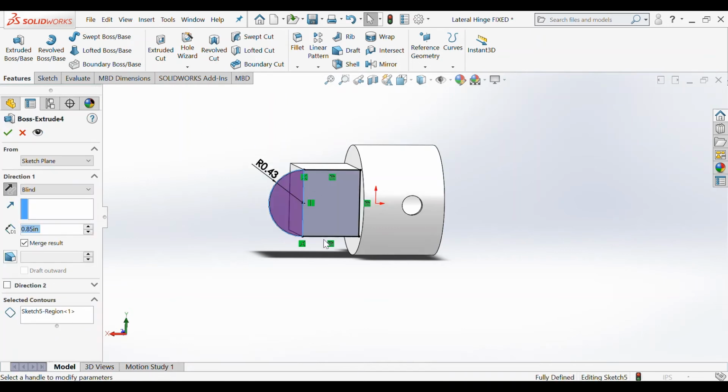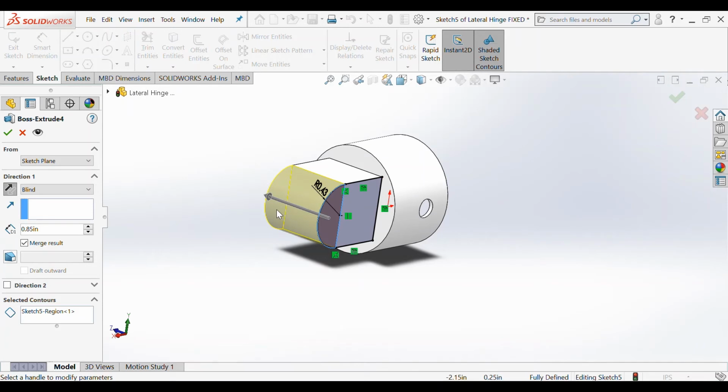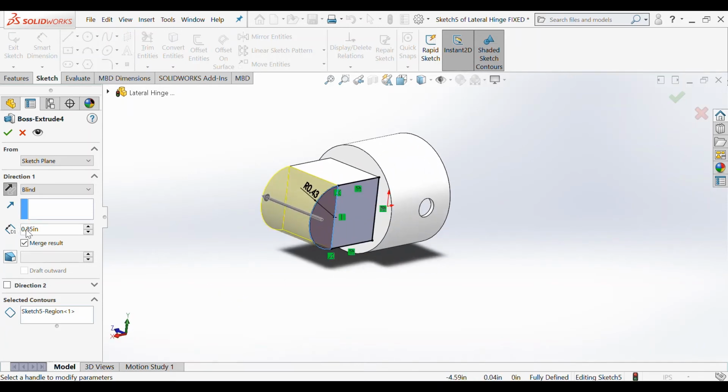We then boss extruded that sketch to have this circular region cover this whole face at 0.585 inches, and we did so blindly.